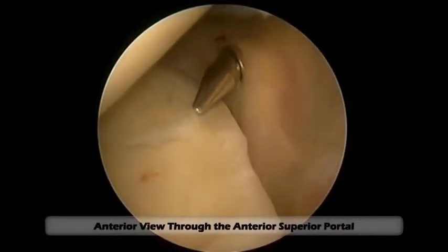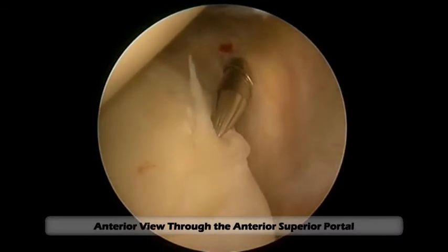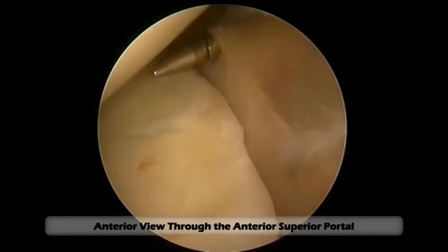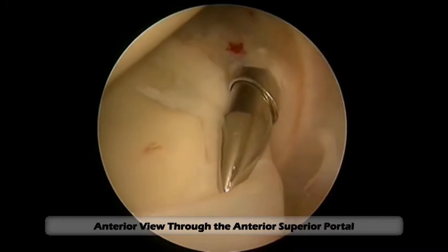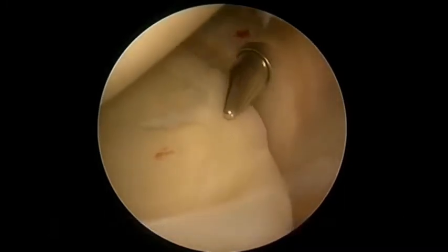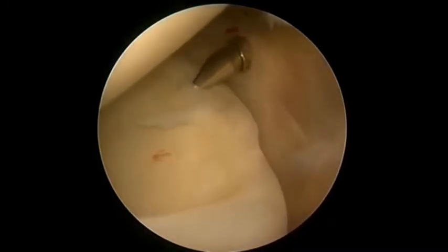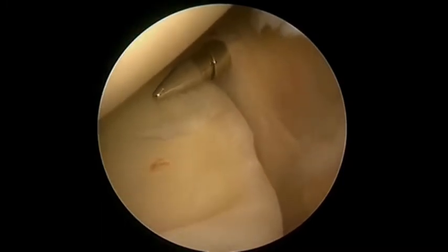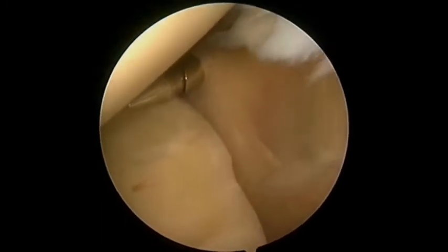Attention is then turned to visualize through the anterior superior portal. The stability of the posterior superior labrum is further evaluated with palpation to ensure that it is stable and does not extend into a SLAP tear.